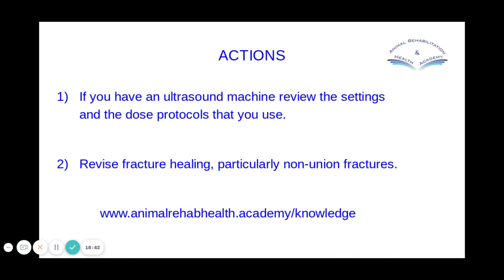So if any of you have any of those cases that have got that horrible non-union fracture going on and you just can't get a repair, I highly recommend you give LIPUS a try.